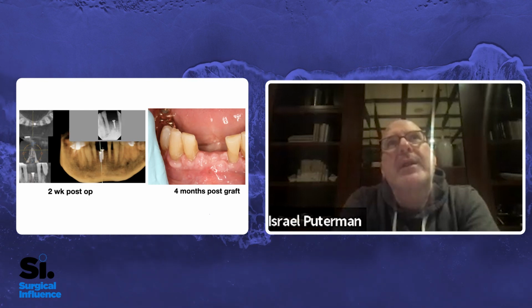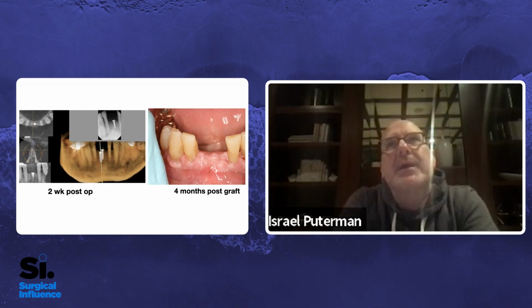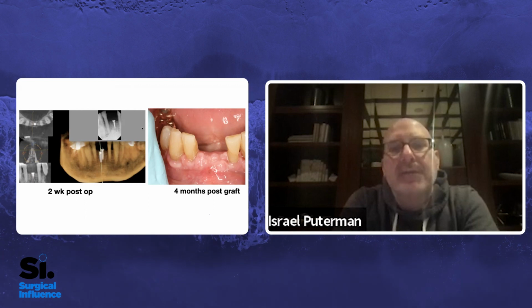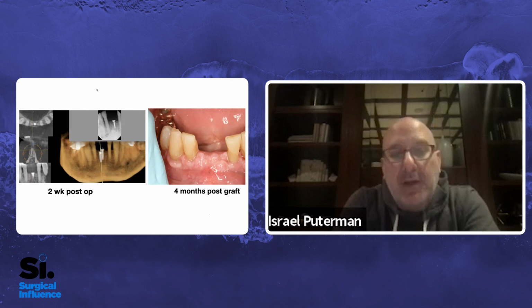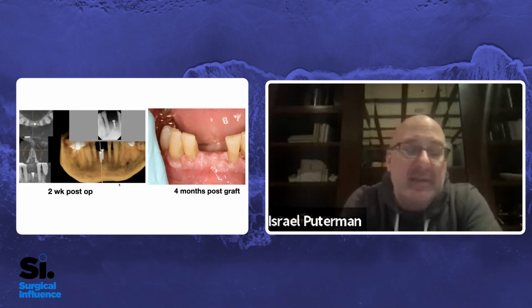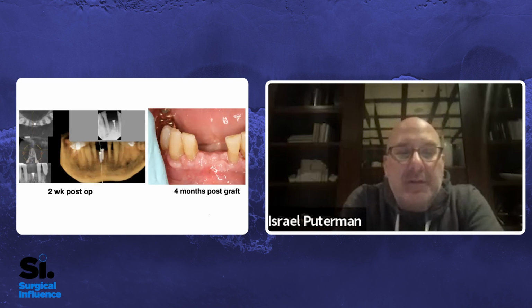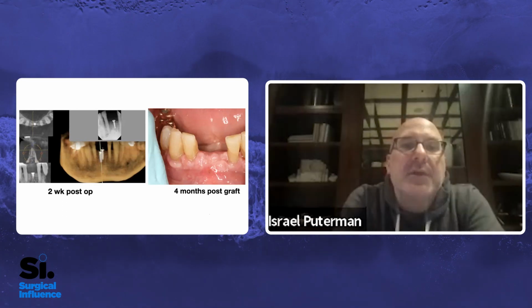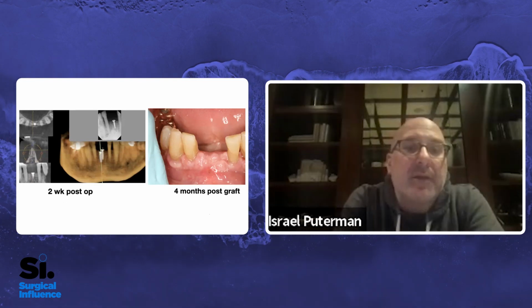Not often, but I could think of one case where there is. I don't think I've ever shown this case, but it was upper left area and grew a ton of vertical bone. And thankfully the adjacent area was more bone than what I thought I would get. So I actually had to end up removing some of that bone to make things level. So yeah, it can happen. The bone can be a little soft, especially if there's a little exposure of the screw head. But it looks like over here he definitely grew enough vertical height to get a good result.